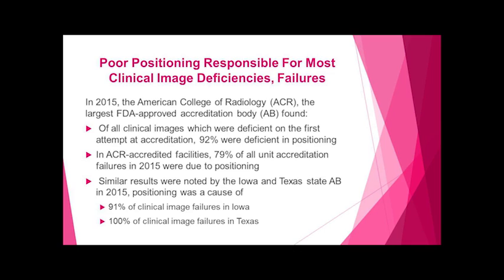You will see that it is hands-on. That means that somebody has to be there to be able to do it. It's like driving a car. You don't learn to drive a car by watching a training video. You actually have to put your hands on the wheel of the car to be able to determine that.